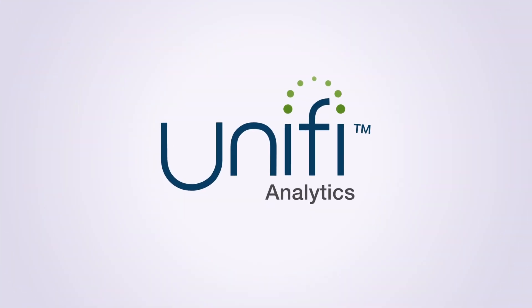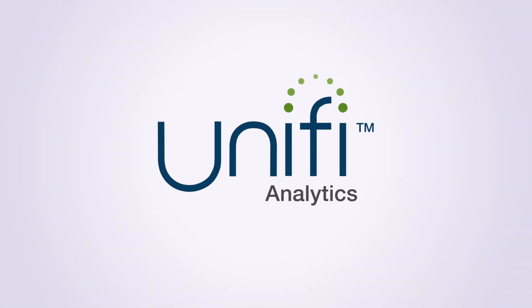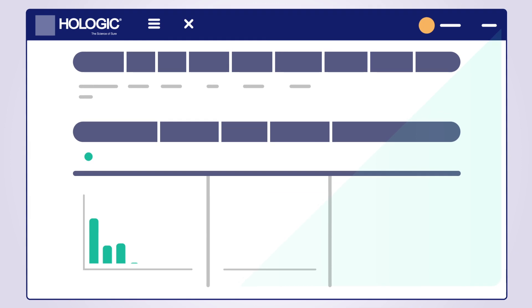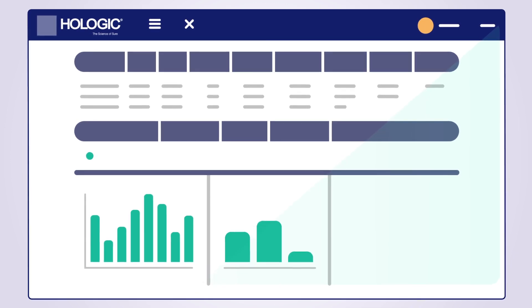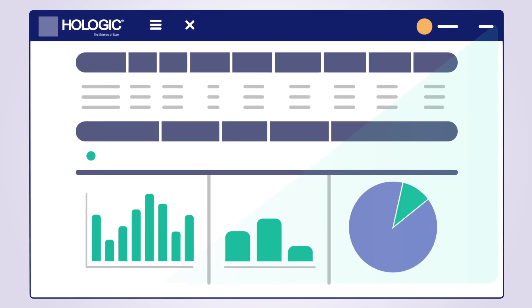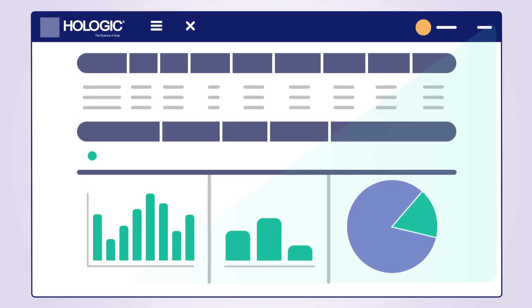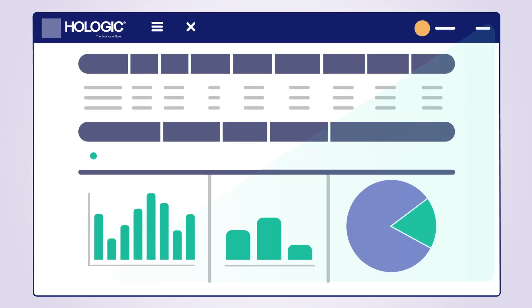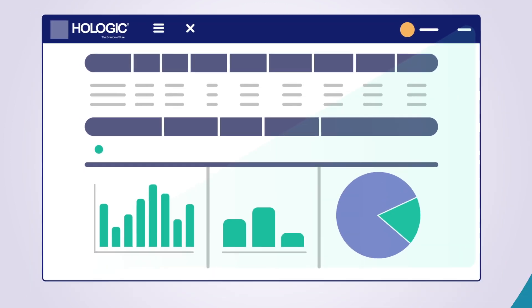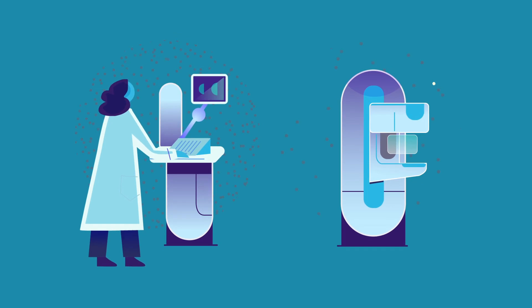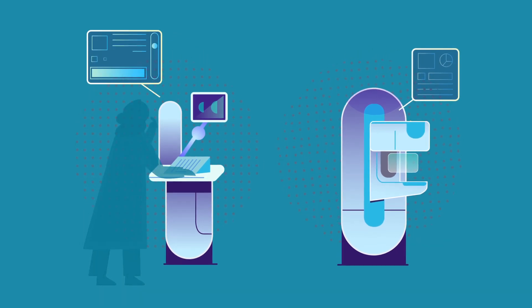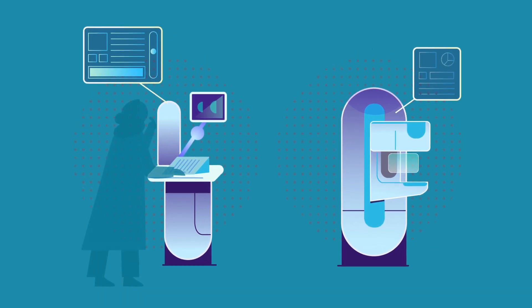Introducing Unifi Analytics. A secure, web-based, intelligent analytics platform that empowers healthcare professionals with insights into device, technologist, and imaging center performance.